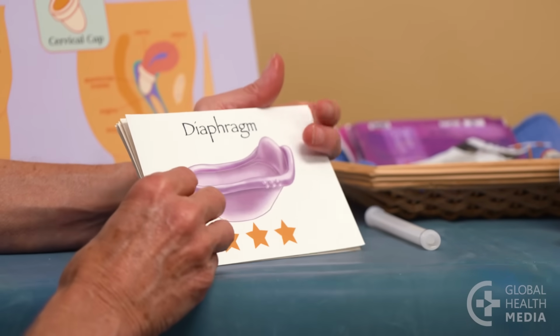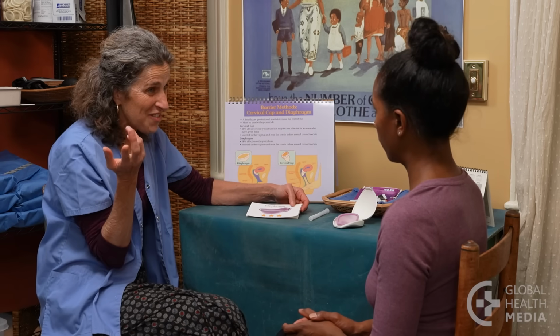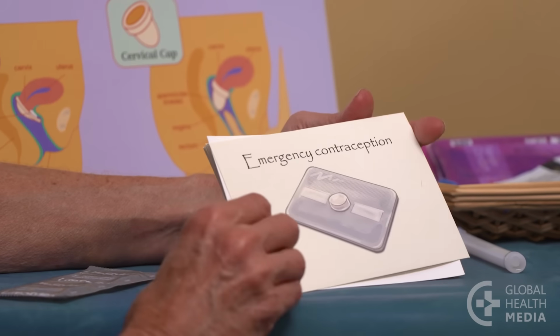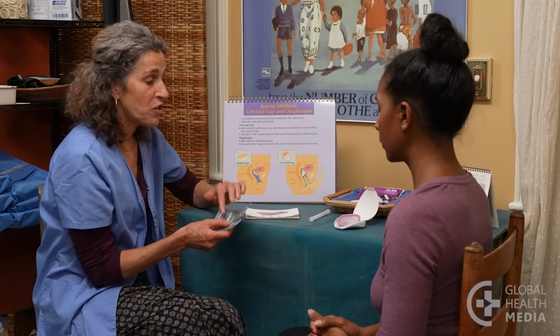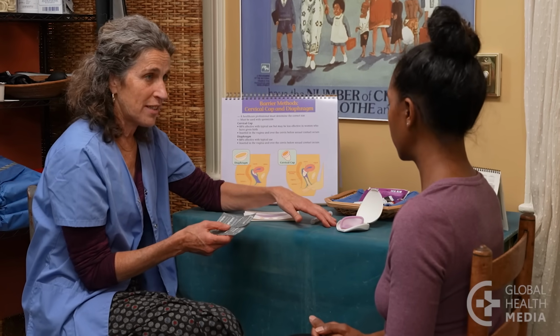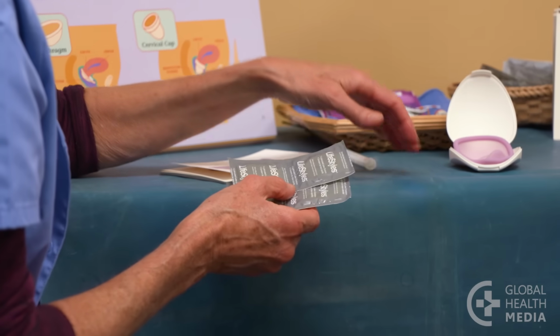After giving birth, you can start using the diaphragm after 6 weeks. If you forget to use the diaphragm and have sex, remember to take emergency contraception to prevent pregnancy. You can use condoms together with the diaphragm to make the diaphragm more effective and protect yourself from sexually transmitted infections, including HIV. Only condoms do that.